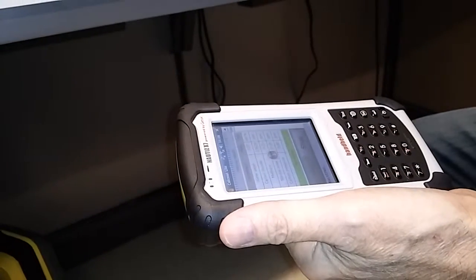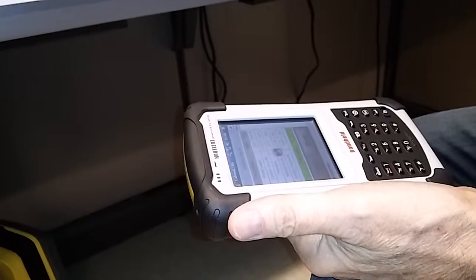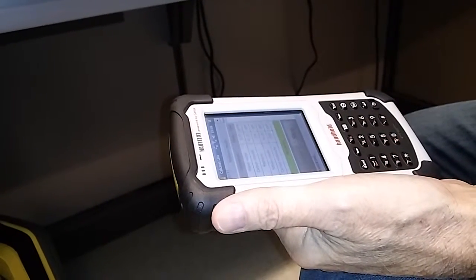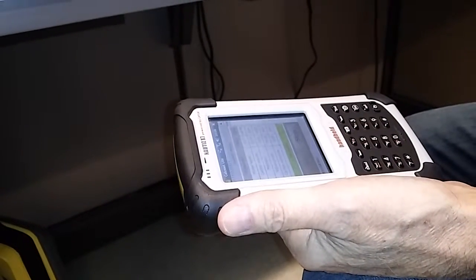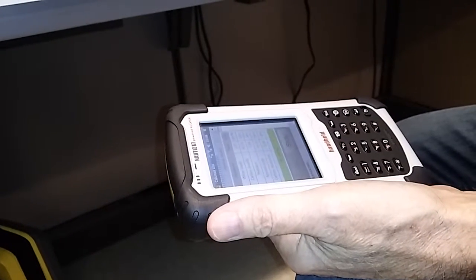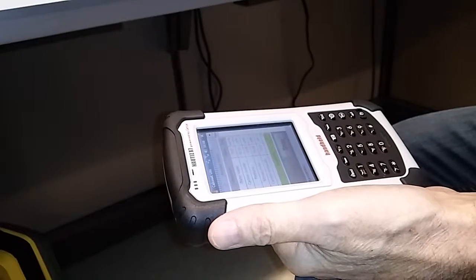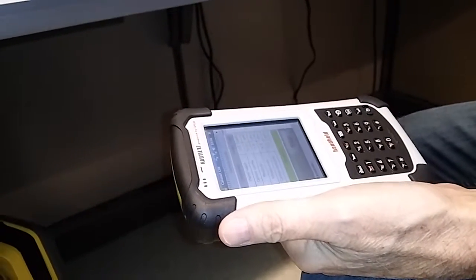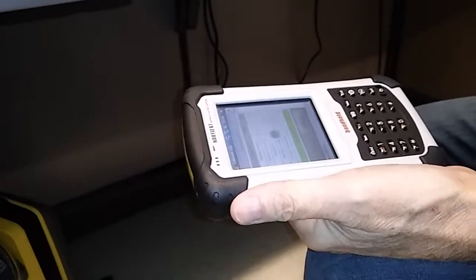Is this the new computer right here? Yes, the small one. Yeah, that's the new computer. That's all connected. Oh, carbon dioxide went down, but 54. Carbon dioxide should still be around 300 or 400. Okay. So I don't know. We'll probably have to do a calibration on the carbon dioxide. Anyway, now the nitrous is up to 54, so it's going to go through another check.